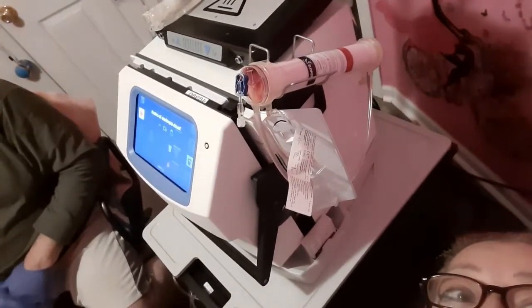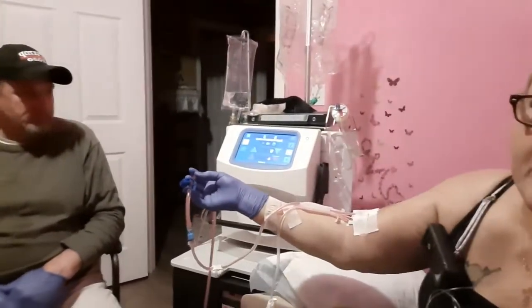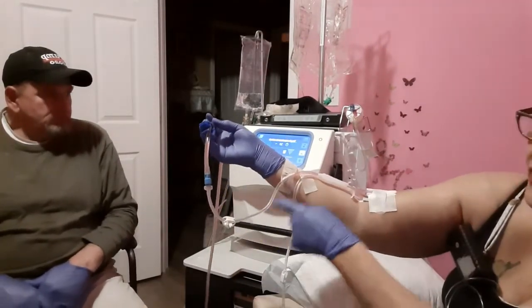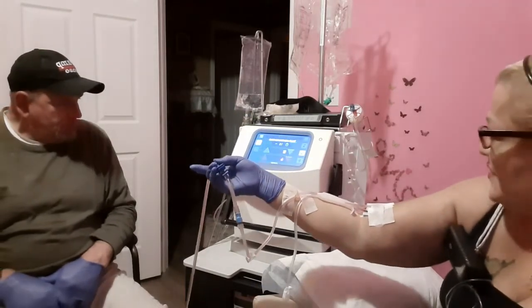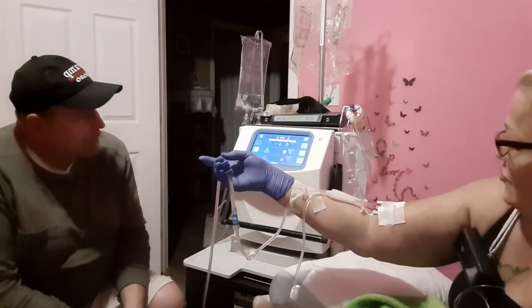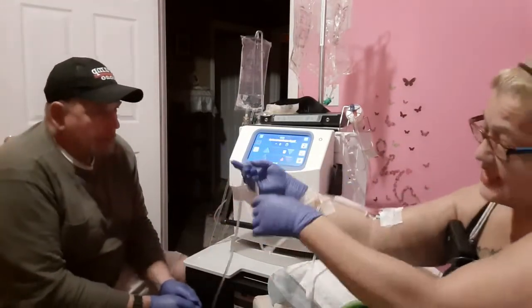the dialyzer is getting lighter and lighter too. There'll be just a small tinge of pink, but it'll be clear. It's already clear. See? It's already clear. Lines are clear. So we got 15 left, 12, 9, 5, 2, and we've reached our zeros. We're done, but we have to disconnect here.